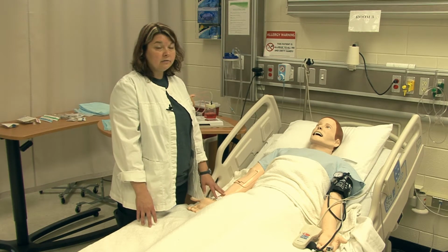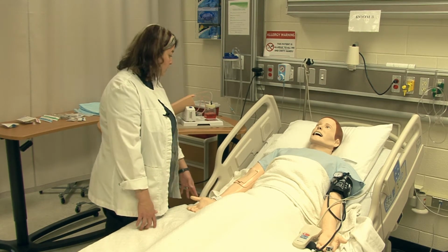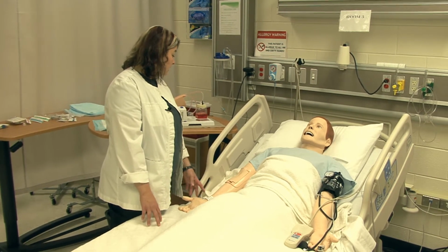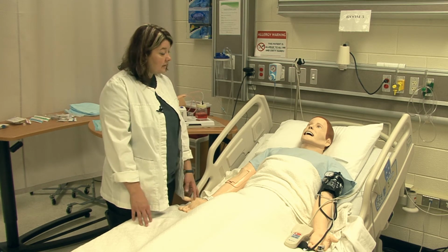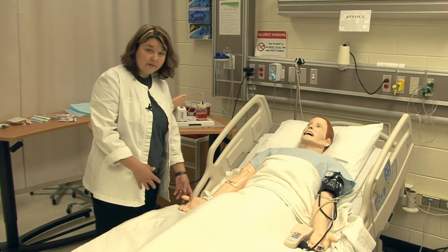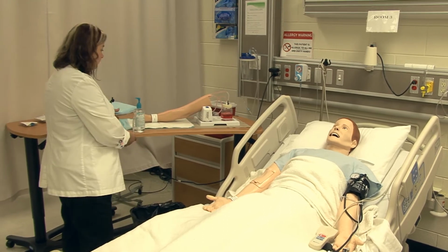I've confirmed any allergies, and I've confirmed my patient. And certainly before we leave the room, we'll thank the patient. So Mr. Smith, I'm going to go ahead and take a look at your arms and be assessing to see where the appropriate place to put the IV is at this point, okay? And he says he understands, and I'm going to step away for just a minute and make sure, of course, that he is safe and has his call bell while I'm moving around in the room.